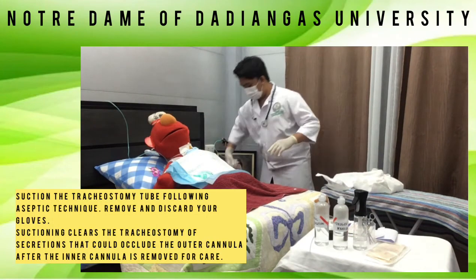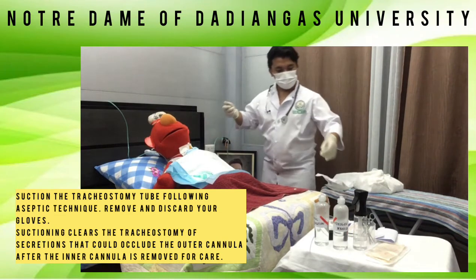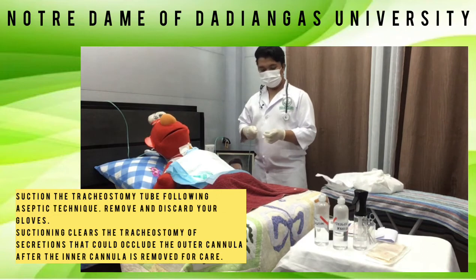Suction the tracheostomy tube following aseptic technique. Remove and discard your gloves. Suctioning clears the tracheostomy of secretions that could occlude the outer cannula after the inner cannula is removed for care.